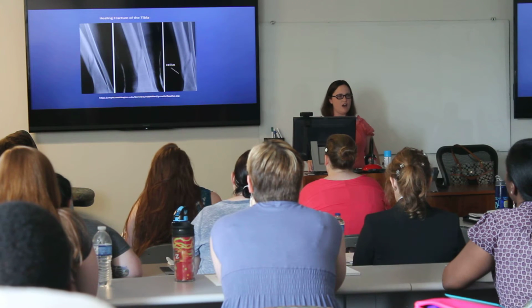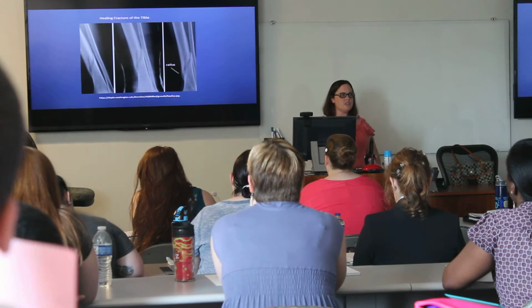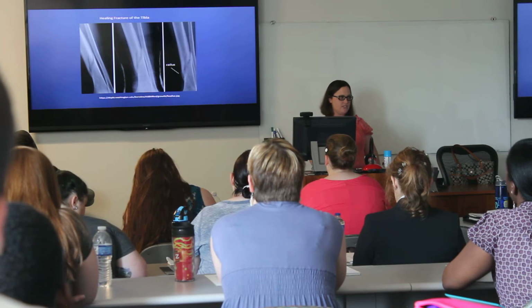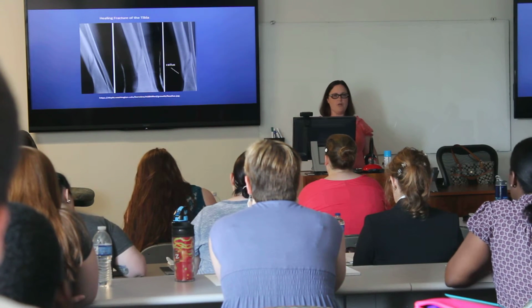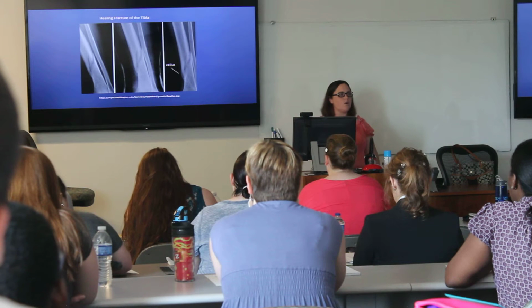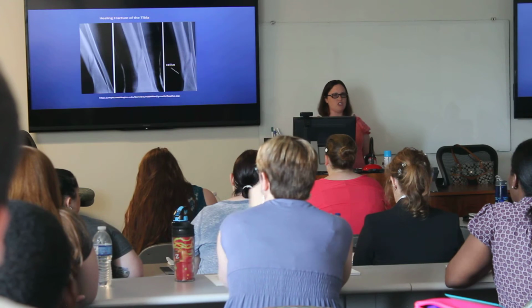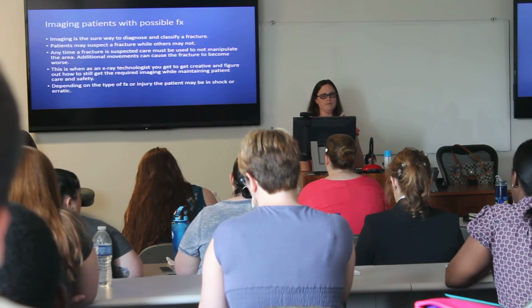Do you see how subtle of a detail that is? So if you had underexposed, you would lose that detail of that new bone growth. We wouldn't be able to see it. And if you overexpose, meaning you were too high in your technique, you would blast right through it because it doesn't have that same density that the normal bone has. So it's very important when imaging fractures to make sure that you're getting a really good technique.